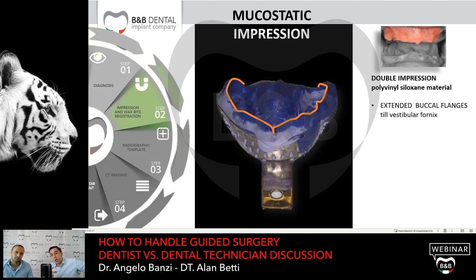The double impression is a very good option, because we have the possibility to take the first impression with the base material, and the second impression with the light material gives the precision, the best shape of the soft tissues.